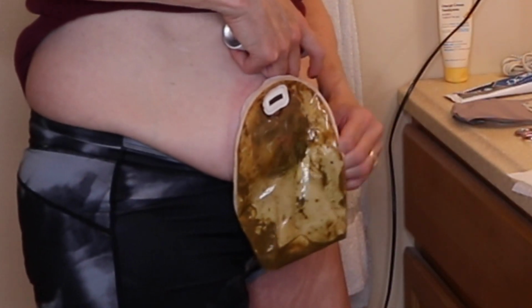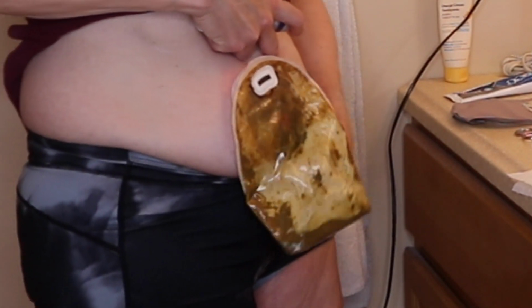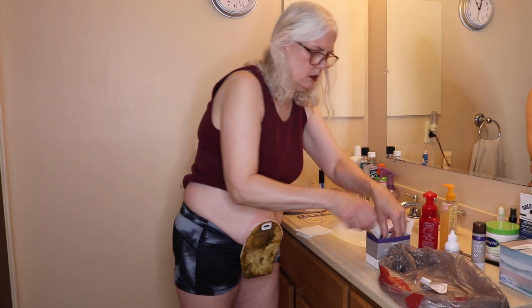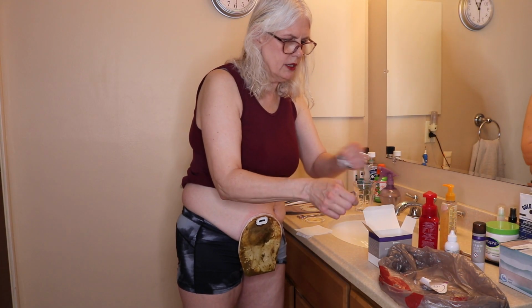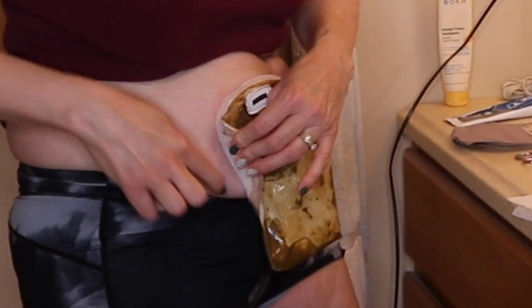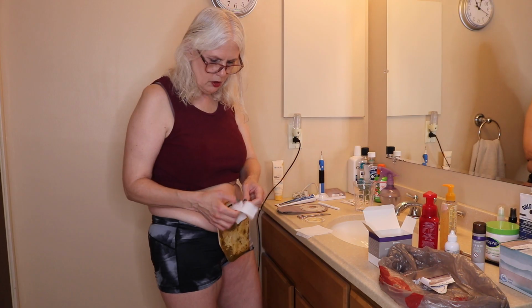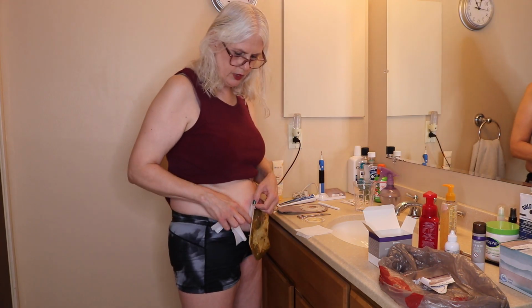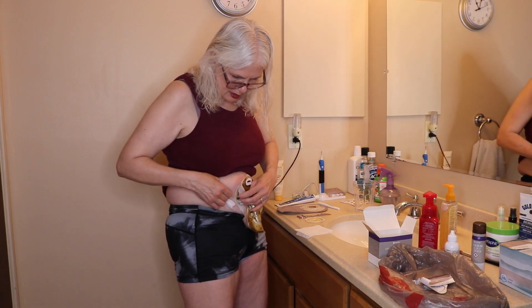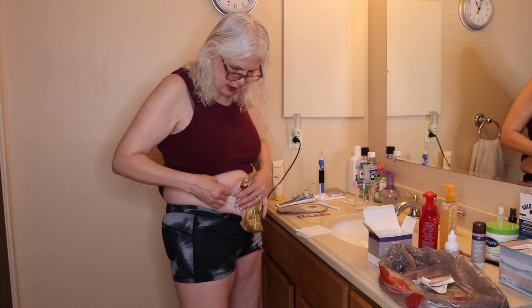With this bag, like I said, one of the cons, per se, of this bag is that the flange around it leaves a lot of residue, like clothing residue. So I try to leave my bag on. I take off this tape ring type part. I leave the other barrier on if I can. This is going to happen again. Okay. And then I try to clean off all the clothing residue. So again, I'm protected.